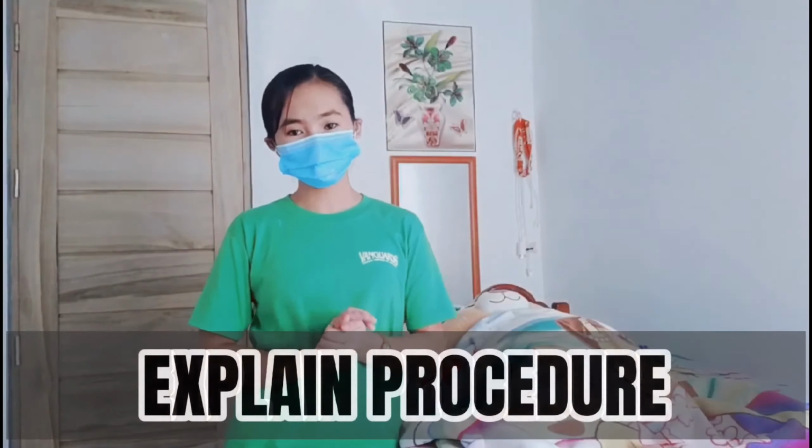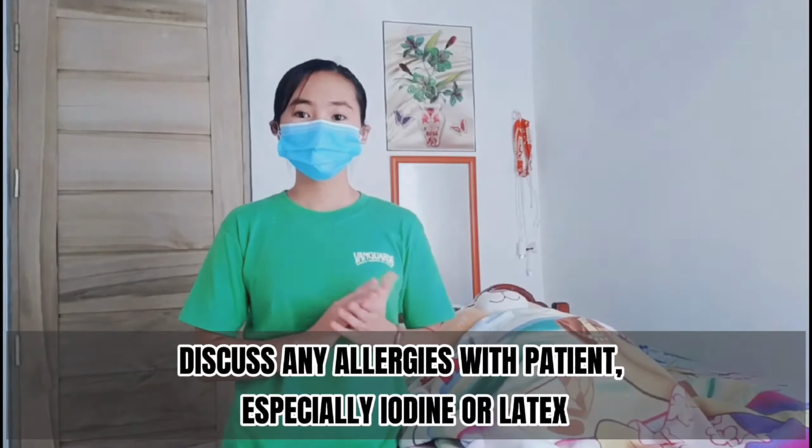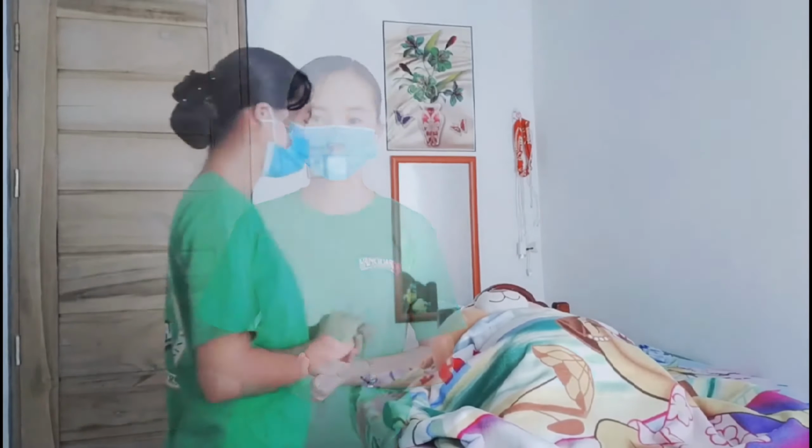Then we are going to explain the procedure to the patient to encourage her participation and reduce apprehension. We are also going to ask if she has any allergies to latex, iodine, or shellfish, because most catheters, gloves, and kits are made of latex and some antiseptic solutions contain iodine.